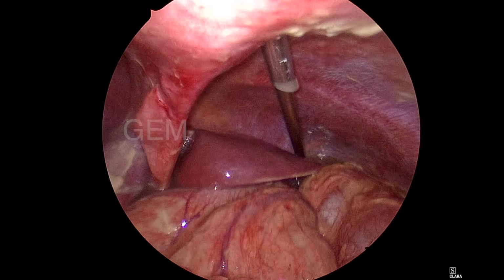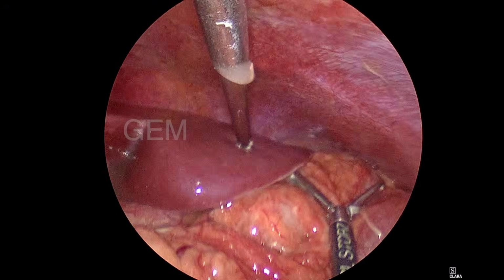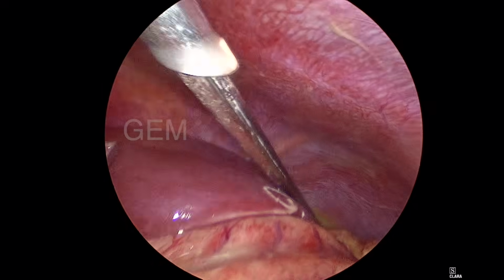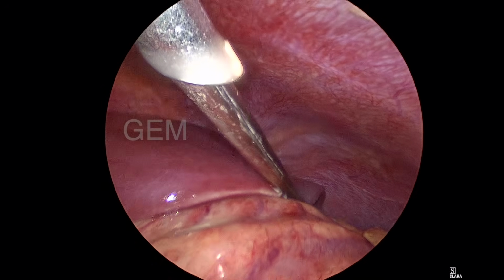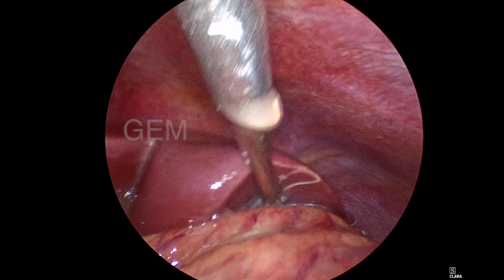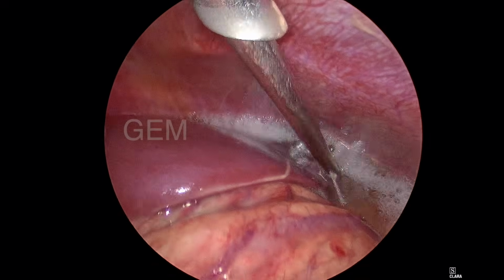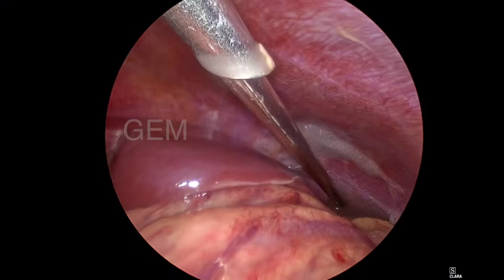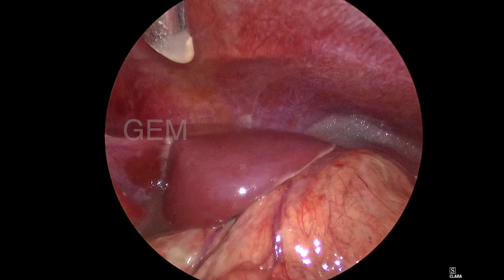Now you can see I am washing the left hypochondrium and the left diaphragmatic surface, and you can appreciate the pus content there. Then the epigastric area below the liver, the stomach, the lesser curvature area. So again I wash the entire area. All the collections, all the areas will be washed out. And for this, the epigastric port is helpful. It is very nearby, so we are able to give the wash.